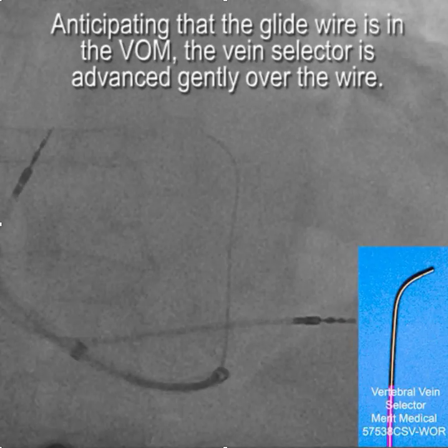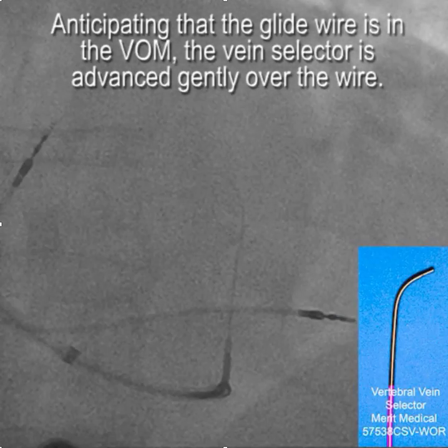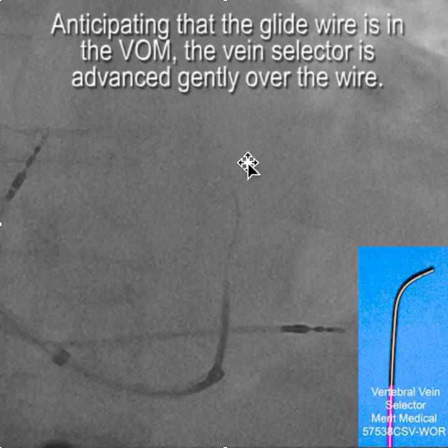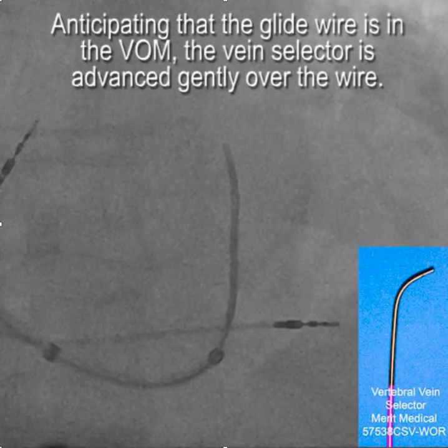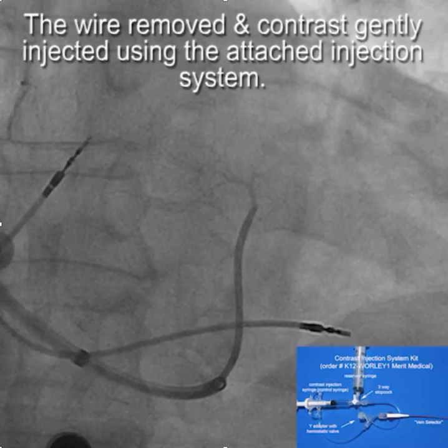So we're gradually advancing the vertebral vein selector over the glide wire, anticipating that the glide wire is in the vein of Marshall. Once we got it into position we wanted to confirm where we were, so using the contrast injection system we gave a little puff of contrast — half a cc — and yes, there we are in the vein of Marshall.